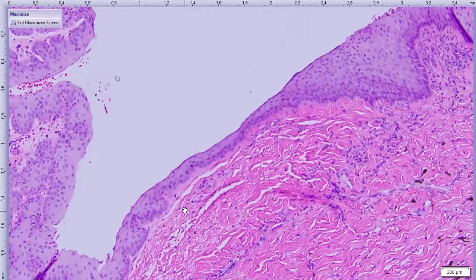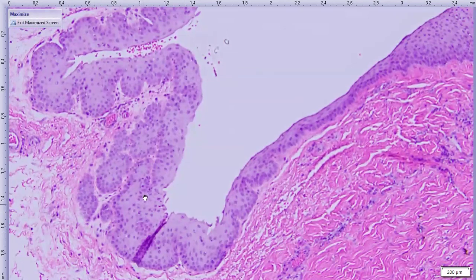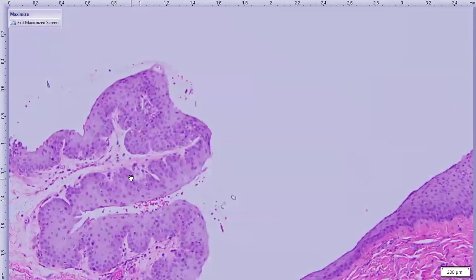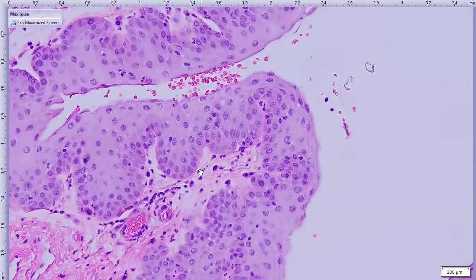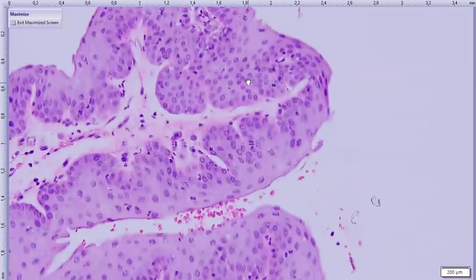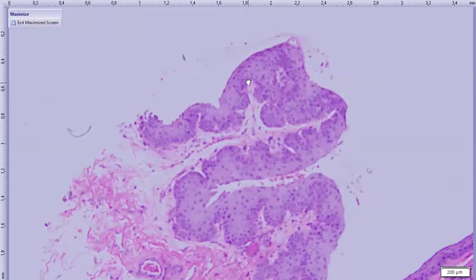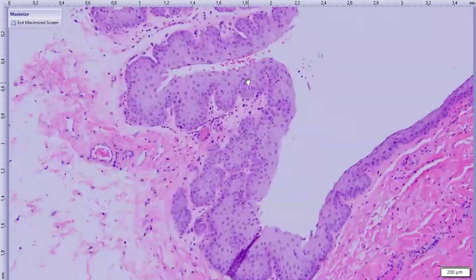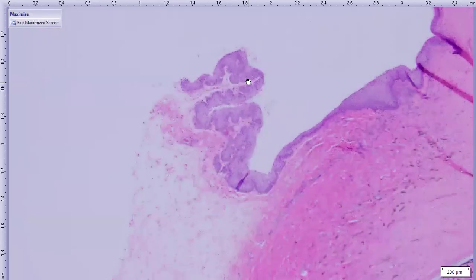The other thing to note is that if we come out here into the limbus and we follow the corneal epithelium out into our conjunctival epithelium, it should be a couple layers thick, and there should be goblet cells. But this epithelium has lost its goblet cells. It's actually composed of stratified squamous epithelium that's probably even keratinizing a little bit. So this is some epithelial hyperplasia and squamous metaplasia of the conjunctival epithelium, which would help support their clinical diagnosis of KCS.